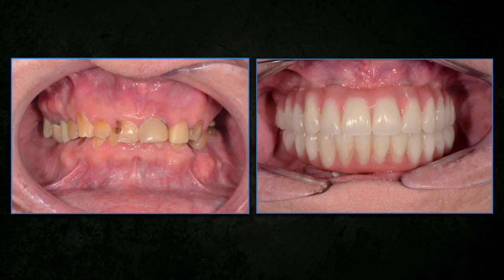And that's a better look of how, if you look where the vestibule is, how much bone was tabled to be able to do this.